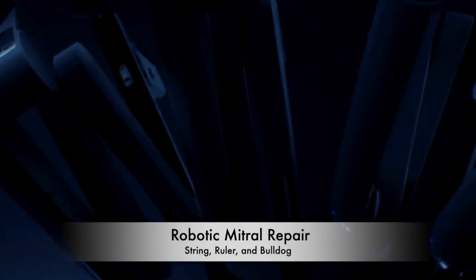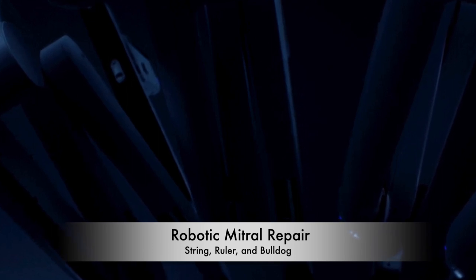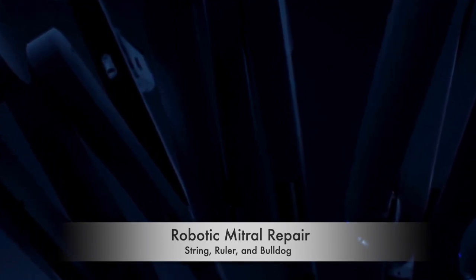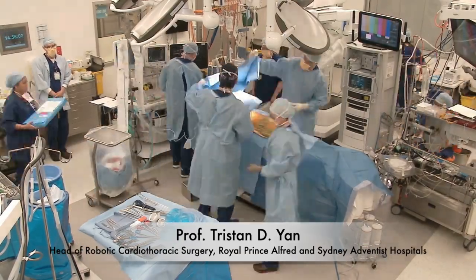I'd like to share with you a simple technique that I use for most of my robotic mitral repair procedures using a string, a ruler, and a bulldog. My name is Tristan Yan, I'm a cardiothoracic surgeon based in Sydney, Australia.